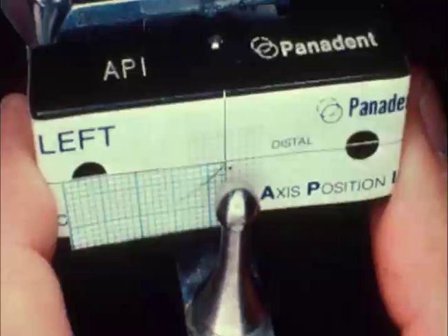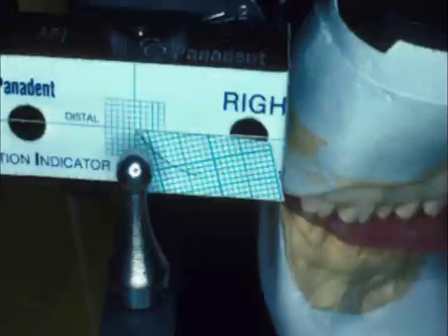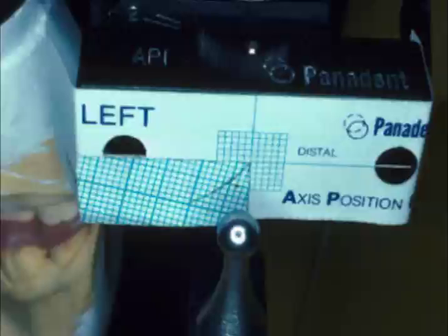So here on the patient's left side, we can see the condyle is being fulcrumed away from the eminence about 1 millimeter. On the patient's right side, we can see the condyle is down the eminence, and that's a pure slide. And here's a case that's part slide, part fulcrum. The part vertically forward from the vertical line forward is the amount of slide. The distance from the pathway straight down to the dot is the amount of fulcrum.